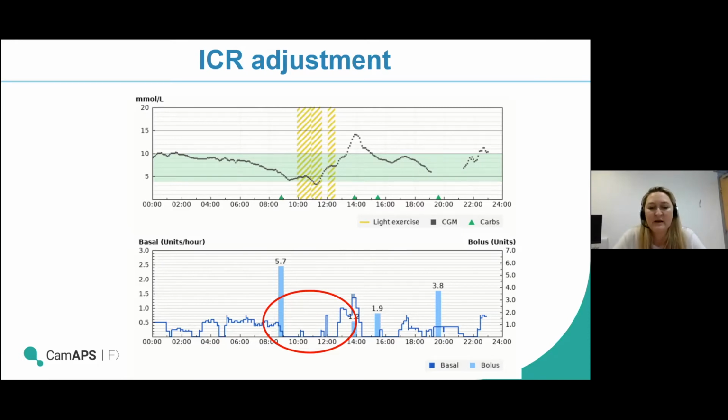The sort of dream is the in between. The first slide you saw where the system had ramped up a lot to deliver lots of extra insulin to try and help. This screen grab, you're seeing it's kind of had to back off to nothing. You kind of want a happy medium where the bolus goes in, the system trickles a little bit of insulin in to help out, but that's as far as it goes, and it helps really keep everything flattened within that 7.8 higher end of the target range.